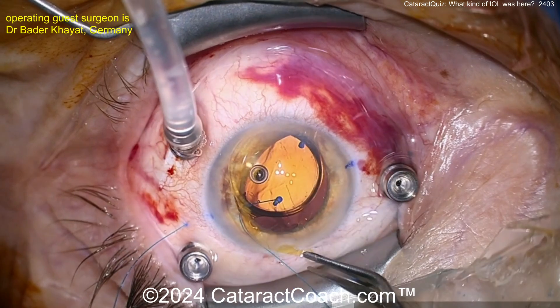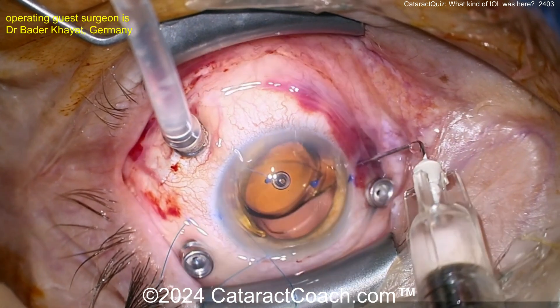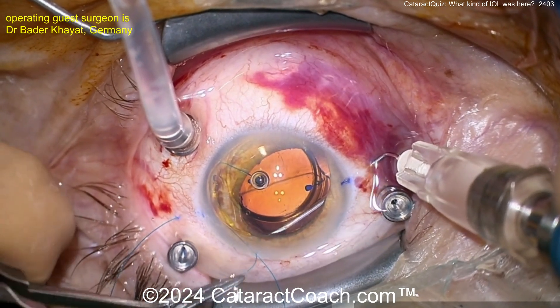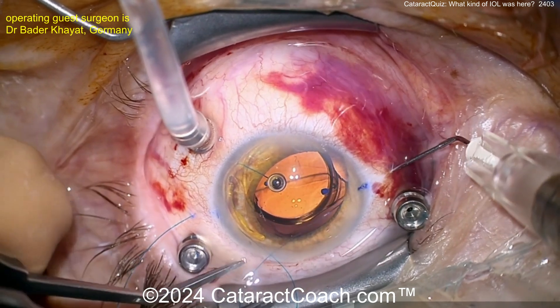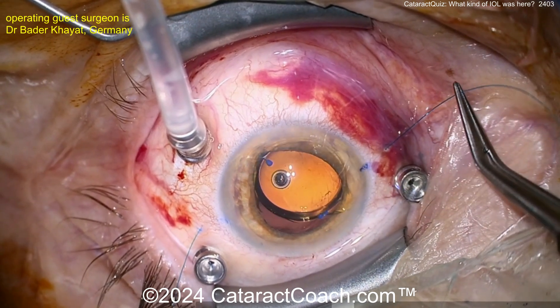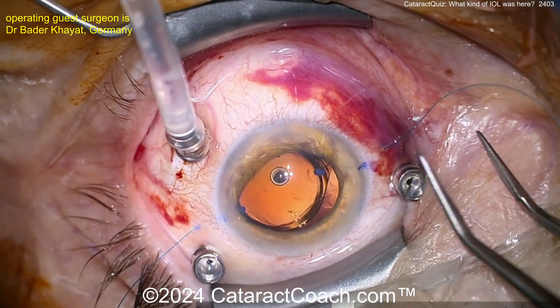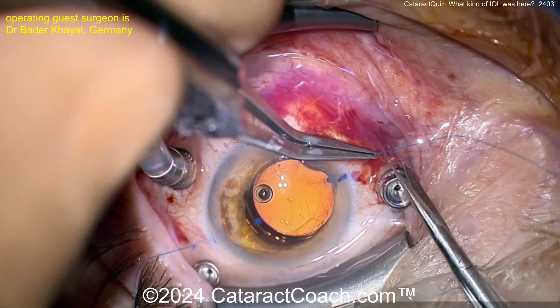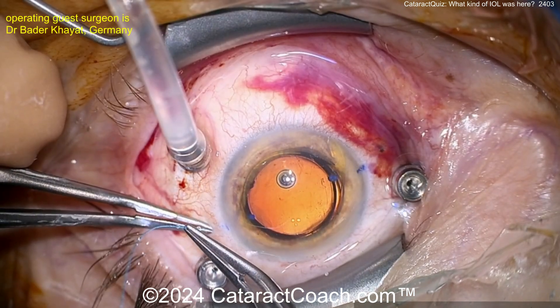You probably don't need those big long haptics here. In fact, it's important that you don't get those haptics entangled with that 7-0 prolene, so make sure you tuck those haptics behind the IOL after you fixate it. Threading in that 7-0 prolene through the hollow-bore needle and then pulling that out of the sclera. Now pull both very gently — look at that — getting the lens in good position. There's one side, here's the other — get that lens centered up. Then you can create some more flanges; holding that with the forceps, cut off that suture, and create a bit of a flange. Make sure you get that flange tucked within the sclera.